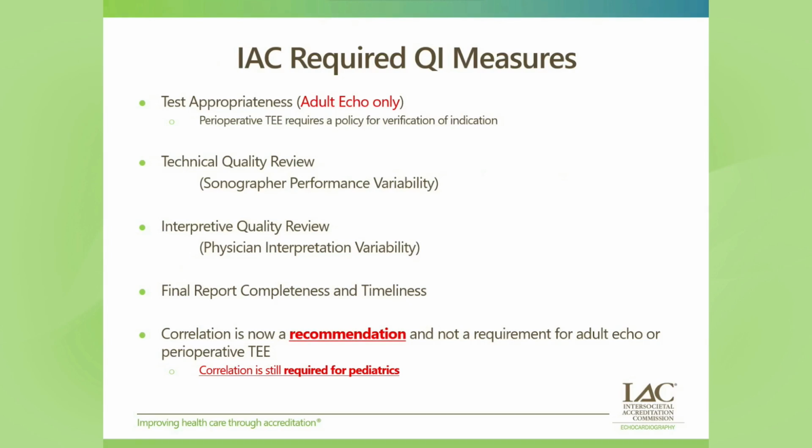First would be test appropriateness. Currently, this is required for adult echocardiography only. Pediatric echo, it's not required to review test appropriateness. However, it should still be done. Perioperative TEE accreditation requires that there is a policy for verification of indication.